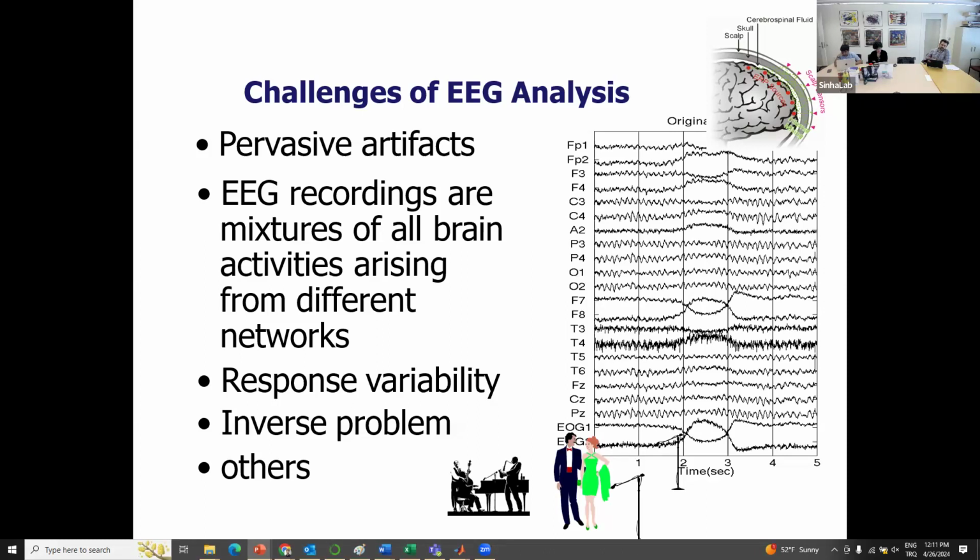So this is the second episode of our EEG analysis series. Therefore, I've already covered maybe a large chunk of the pre-processing steps on multivariate time series data such as EEG. I'm going to first give you a brief background on the challenges of EEG for those of you who come to the second session directly without watching the first episode.